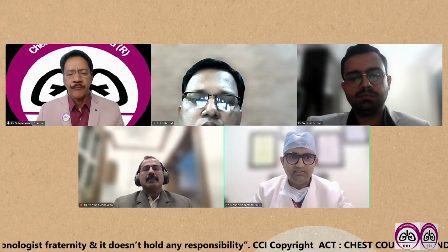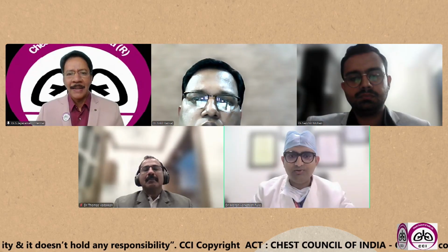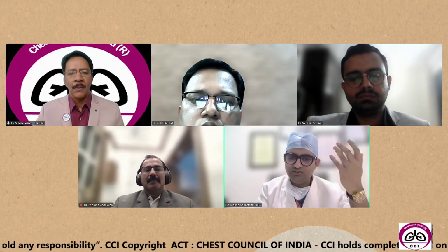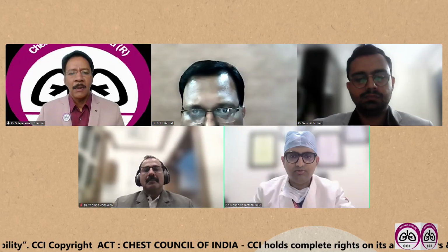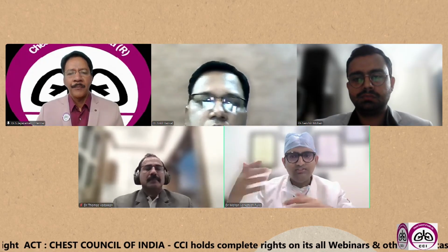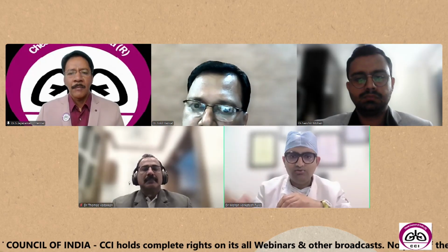The level 5 and 6, if you ask me, I would do by video assisted thoracoscopic surgery rather than extended mediastinoscopy. Level 3 also, I'm more comfortable doing by video assisted thoracoscopic surgery. Level 9 also is by video assisted thoracoscopic surgery. So these are the surgical techniques when it is not possible by EUS or EBUS to sample the lymph nodes.